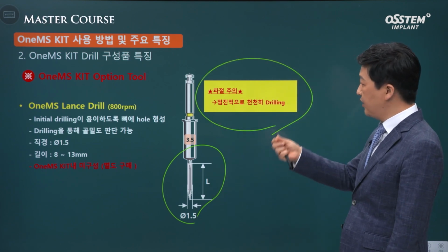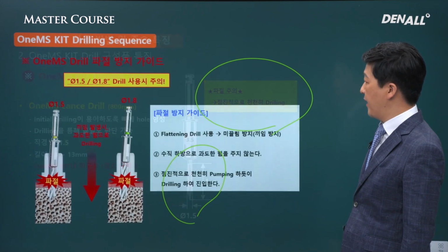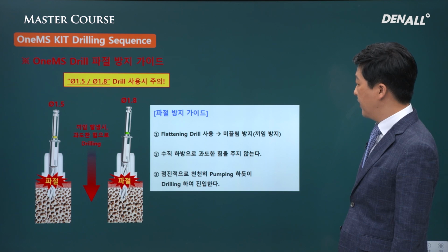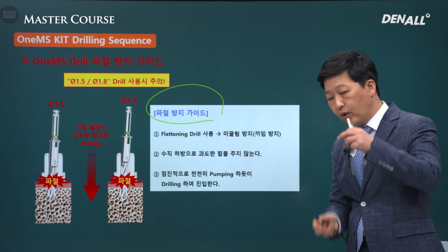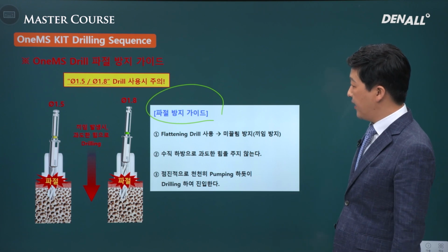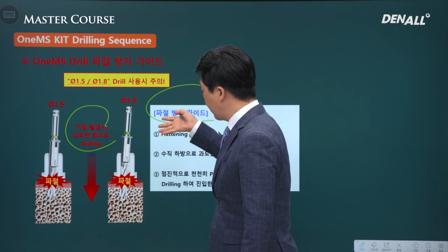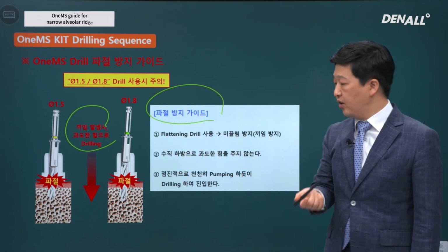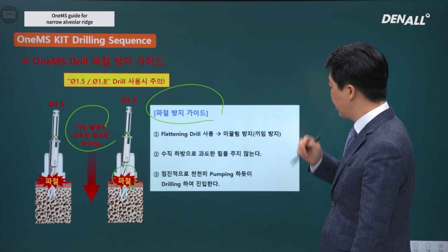So you should not apply too much force. You need to use lance drill in order to punch. There's a high possibility of a fracture. It is very long and thin. If it is stuck too much or if the entry angle is too angled, then this area can be fractured, so you need to be careful about it.